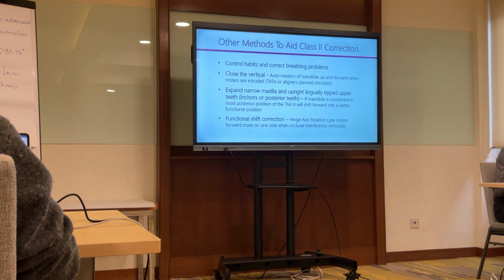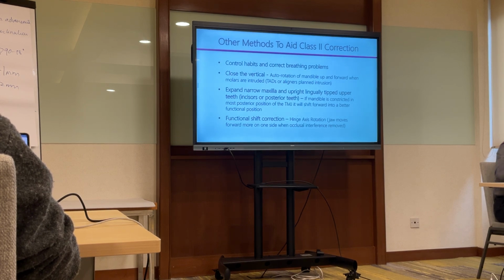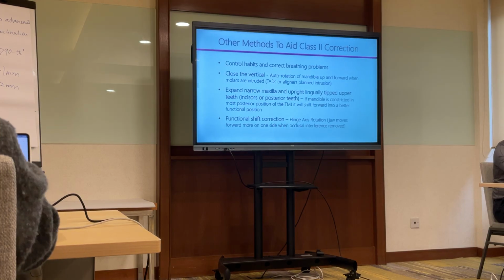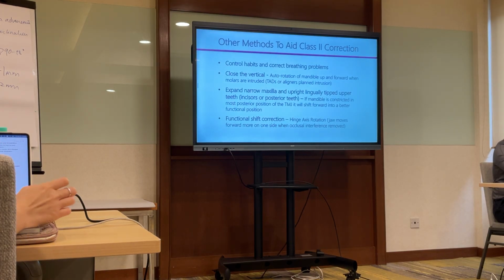When we use the anterior cross elastics, we use it when the arch bar is 19/25. Yes, you could also do it on 18/25. As you're aligning, you can also use anterior cross elastics on 18/25, because you're going to use it only for a short time. If you use long elastics on 18/25 for a long time, it can create a deleterious effect because the wire is flexible. But you're using it only for 2 weeks until the midline is centered.